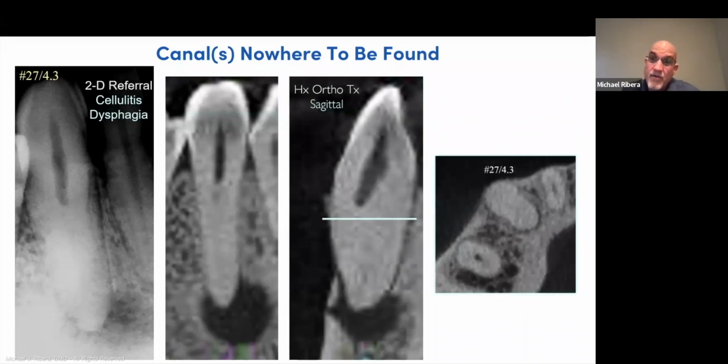At that 1 level, these canals, or the canal, it is just calcified. I opened this tooth up, could not find the canal, didn't get a drop of drainage. He is, again, fairly swollen and his neck is fairly puffed up. Run GentleWave 2 minutes, could not find the canal through the platform, run another 2 minutes, couldn't find it either. I run the entire cycle. After running the cycle, I could not find the canal either. Not a single drop of exudate was expressed from this tooth.